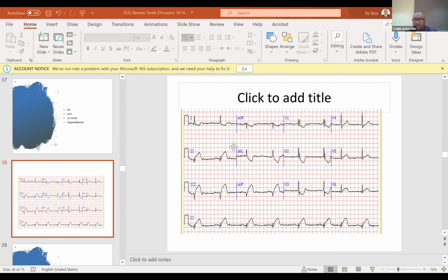Whereas in a hyperacute T wave, the J point is at the baseline and the ST segment is at the baseline; all you see is an acute T wave. A hyperacute T wave is usually a sign of an early MI, okay, and usually the QT with it is short. Of course, here in the emergency room, you always look at the patient presentation, okay.